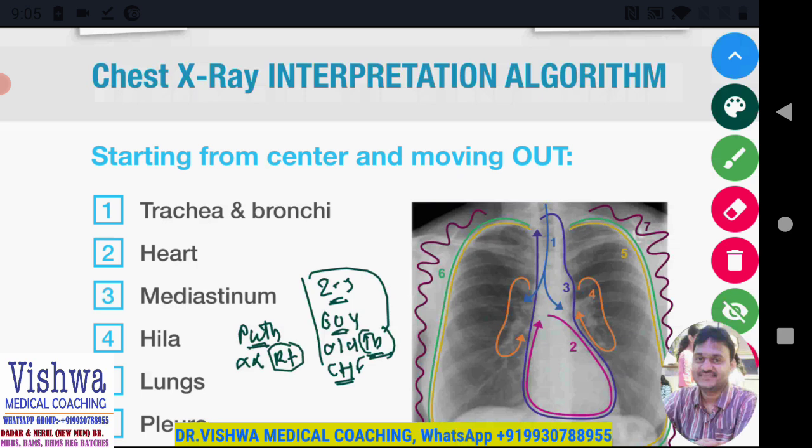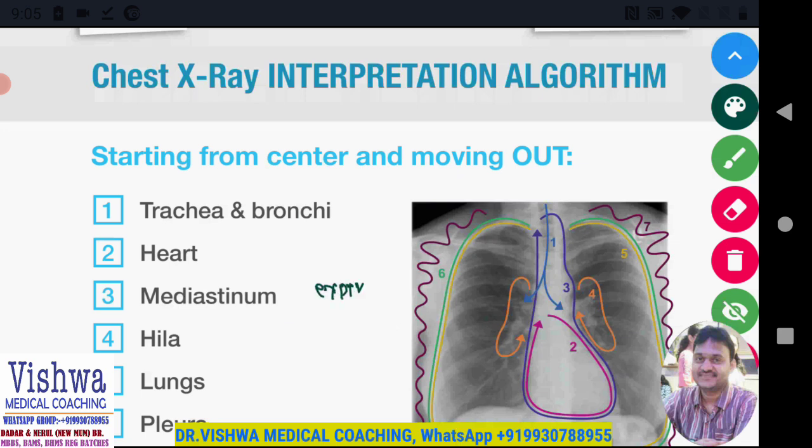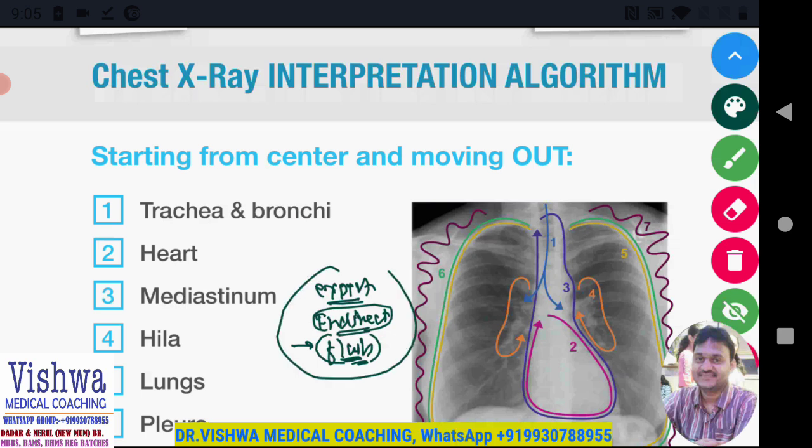So if you go through this step-by-step approach, we are going to understand how exactly to interpret an X-ray. Those who are experts in X-rays indirectly follow these guidelines. Why I'm not saying directly is because they can interpret the X-ray in a flash of a second. Okay, this is the diagnosis. Let's say somebody is a radiologist, they interpret it in a flash of a second.